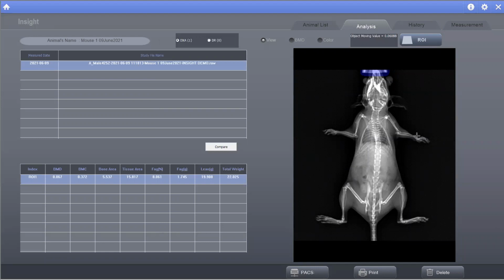And this is where being able to see the pancreas, I don't think is going to be possible using the system, but something like ultrasound, which is something that I'm happy to chat further about, would absolutely be capable of doing that. If there was a tumor, we'd have to be able to see the difference between it and the surrounding soft tissue. Again, there's other modalities that would allow you perhaps better to do that, but it may be possible with the system as well.